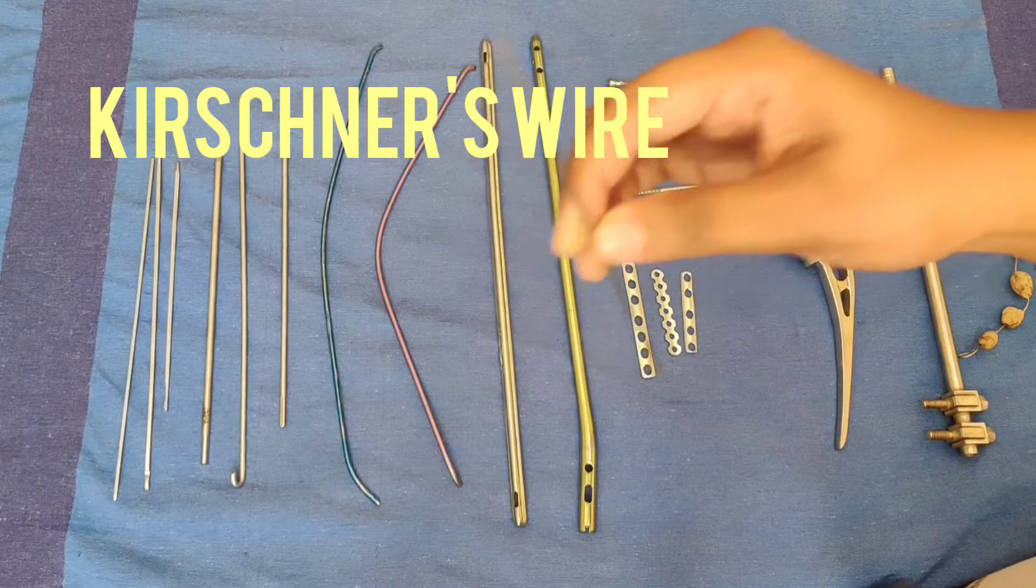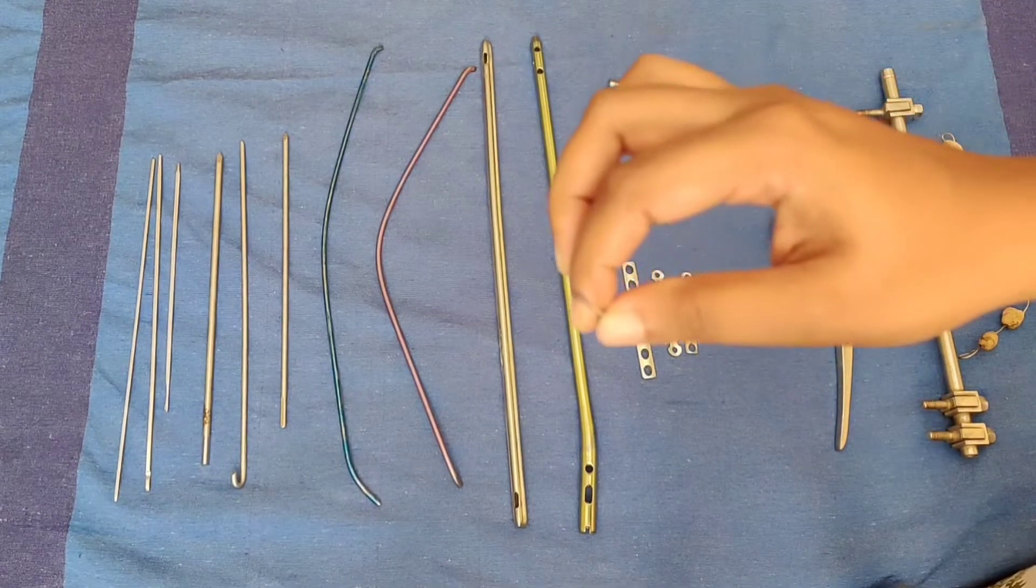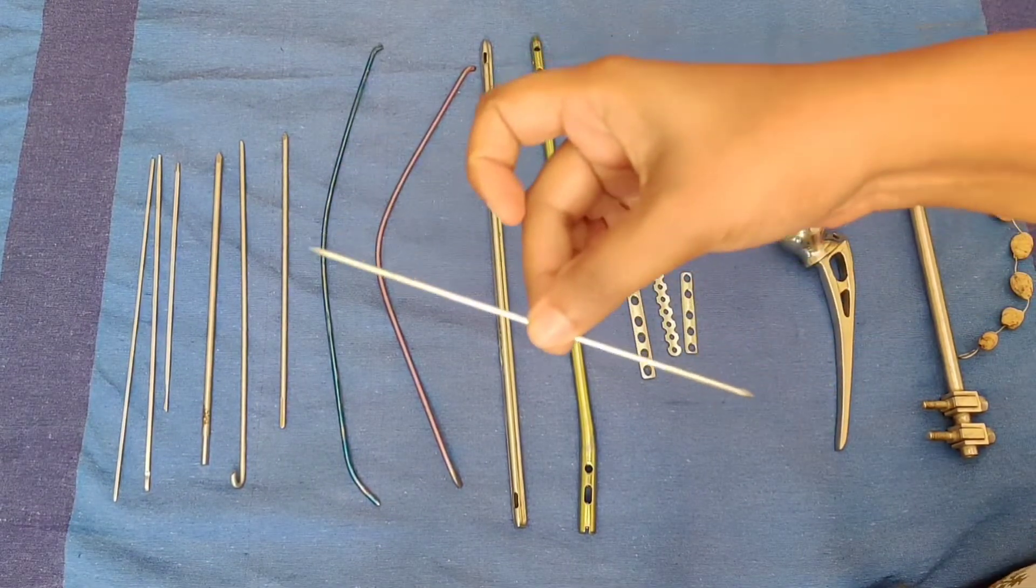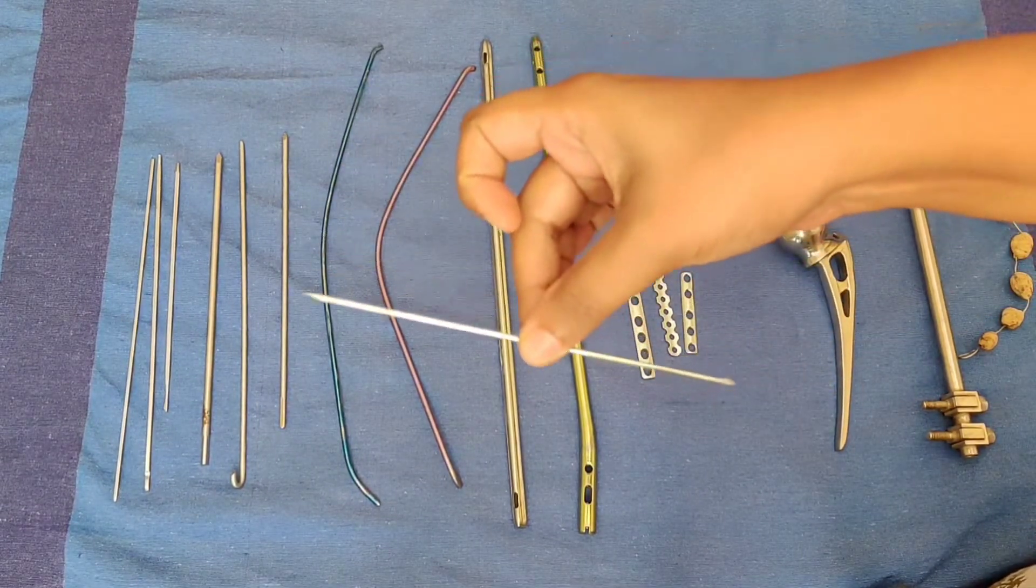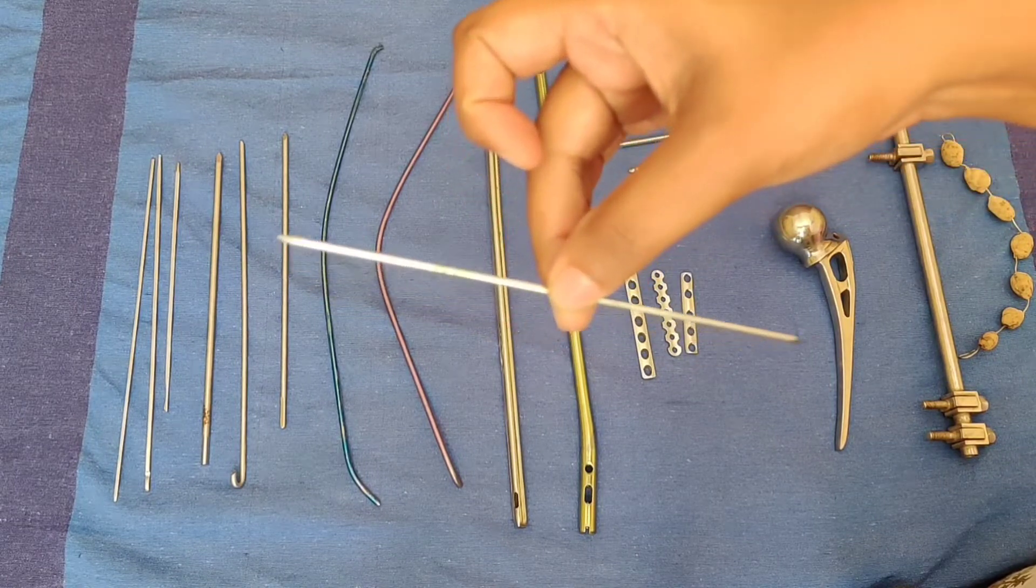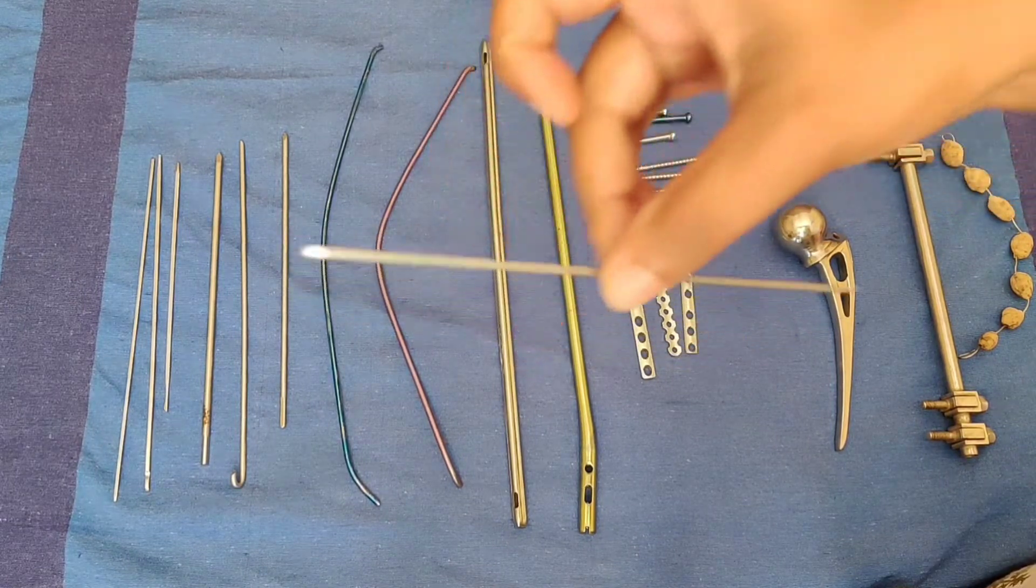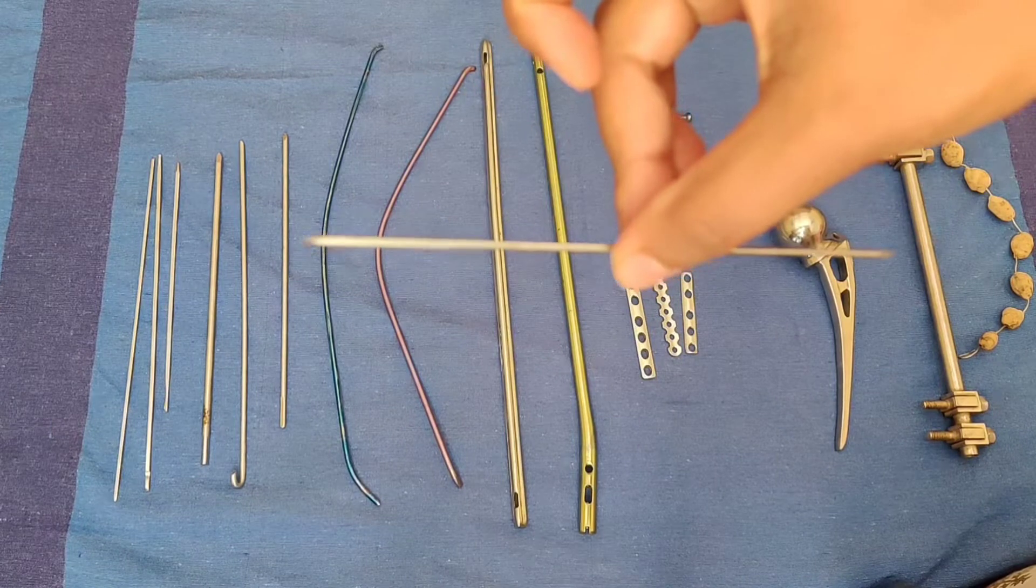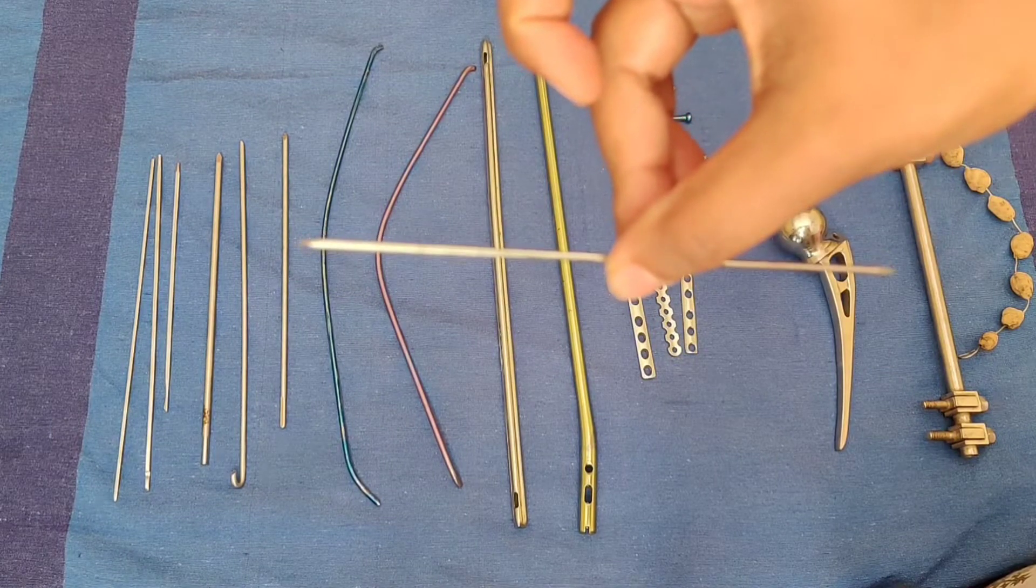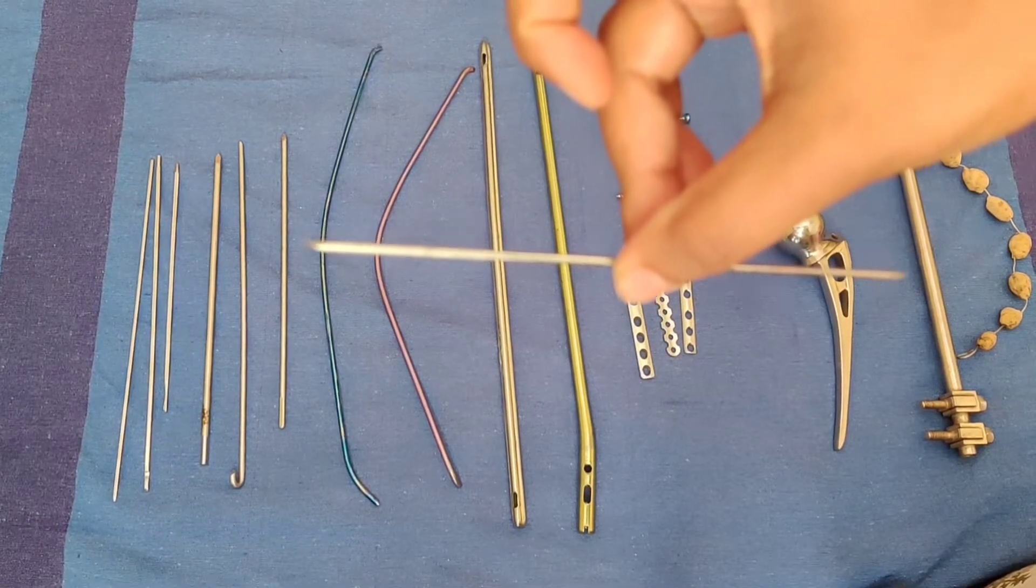The parts are trocar tipped both ends with a rounded shaft. Variations or types of K-wires are smooth and threaded K-wires. The size varies from 1 to 3.5 mm with an interval of 0.5 mm.